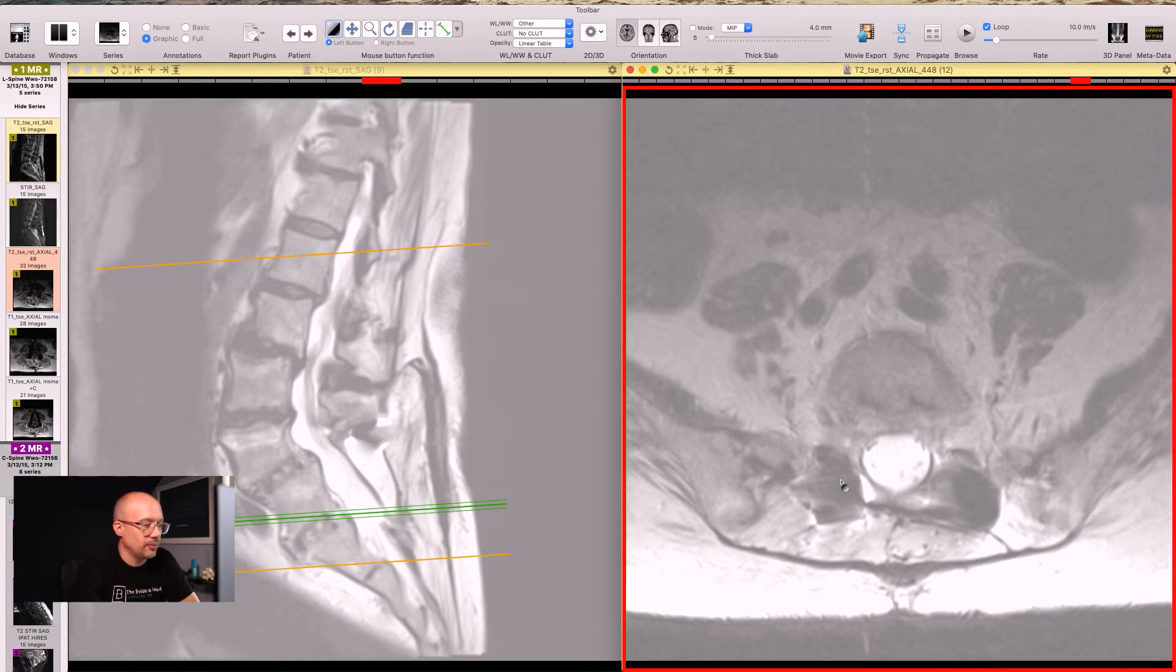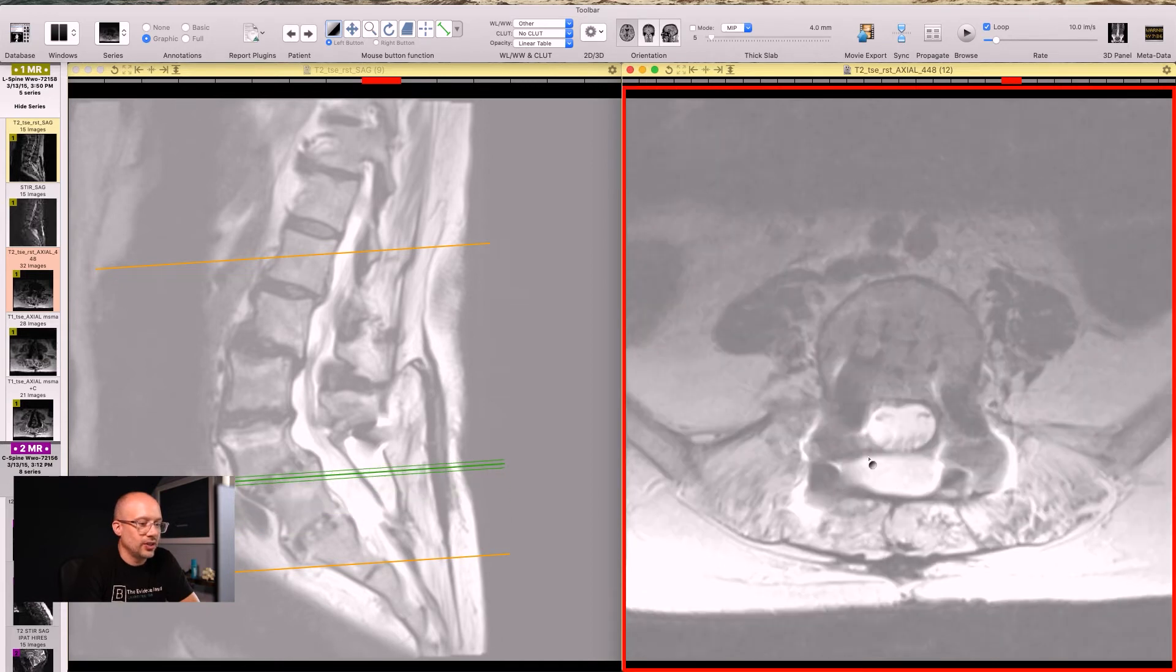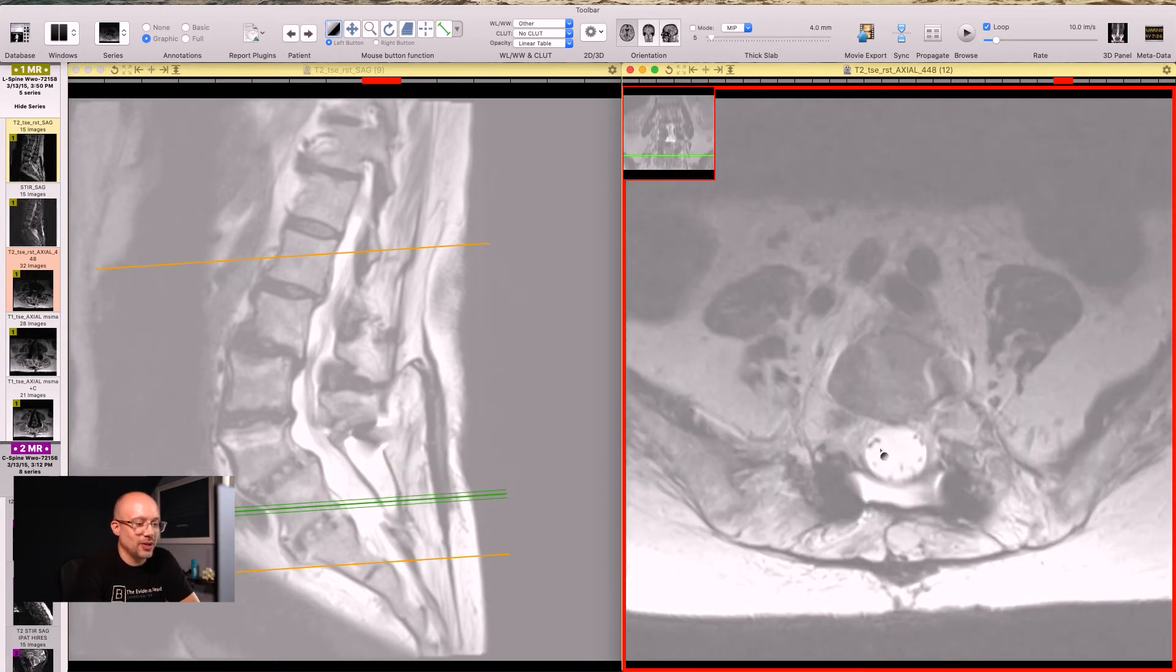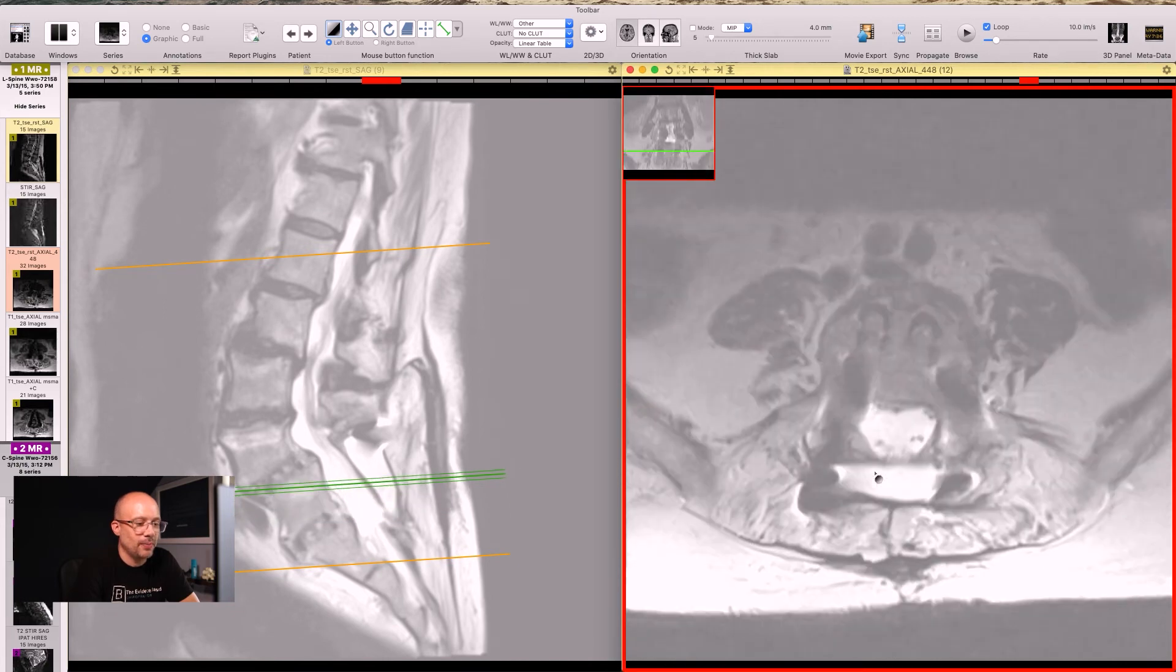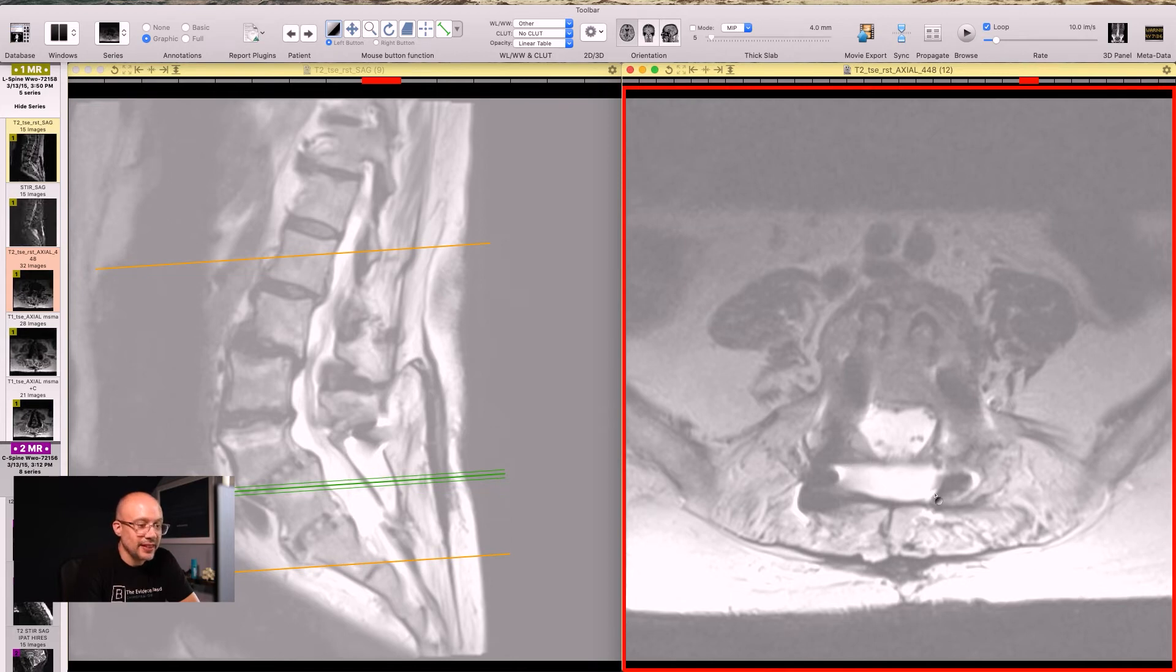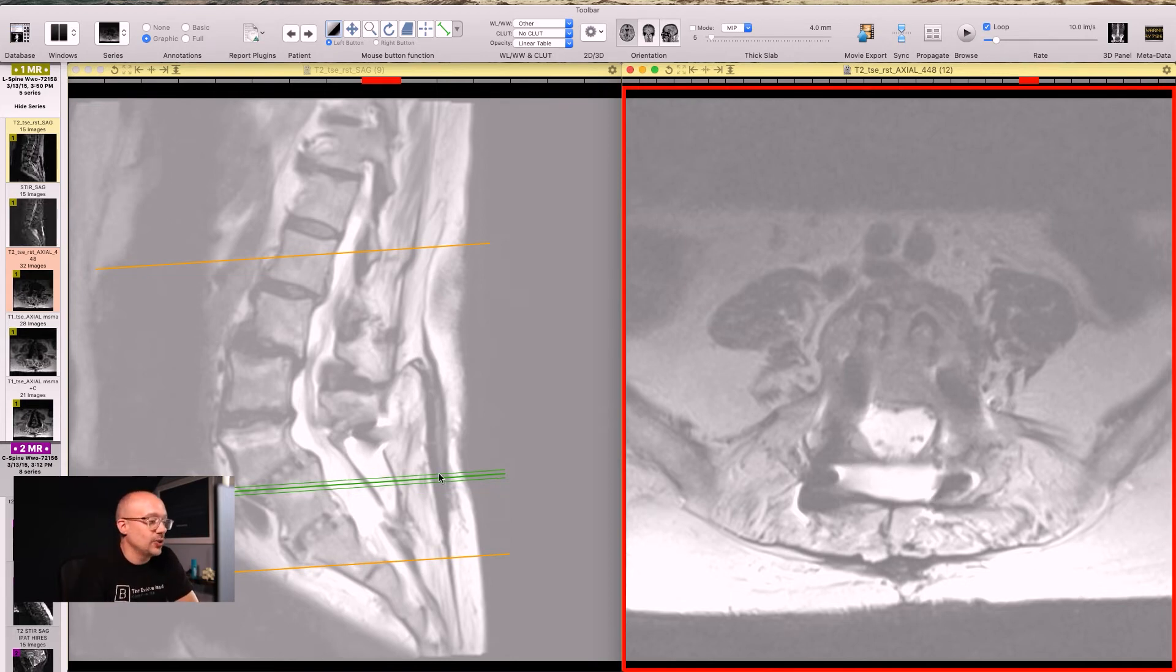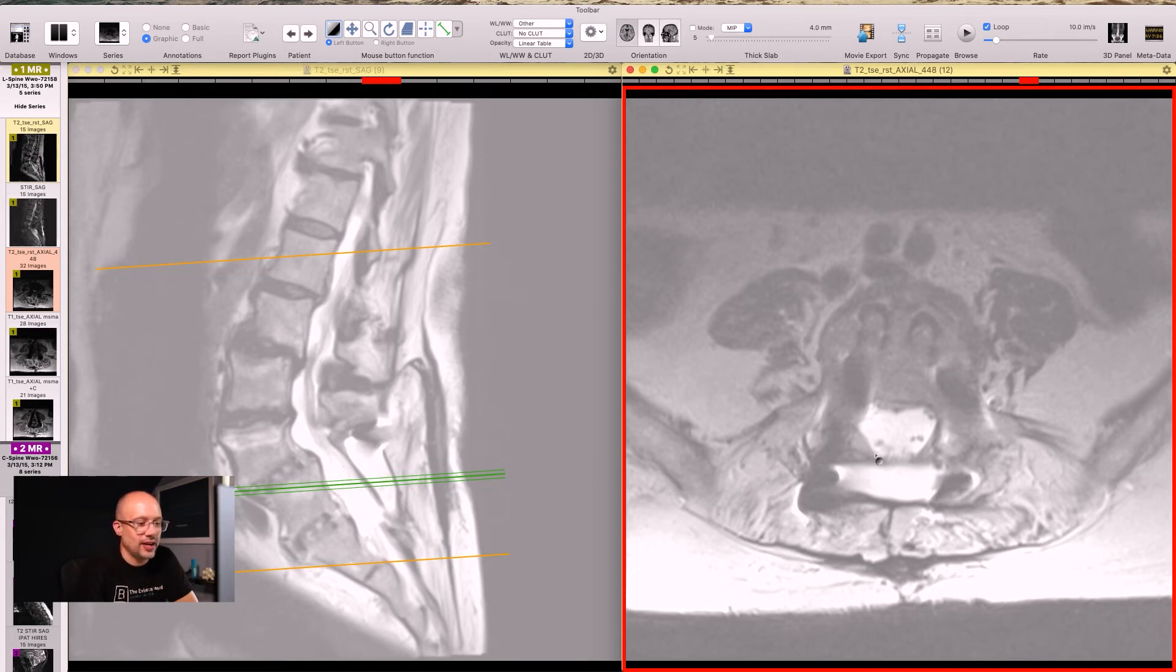Now let's go up a little bit. What you'll notice is, look at all the two white spaces here, right? When you go down on the right-hand side of the screen, one white circle, spinal canal, up a little bit. And we see that second white area. That second white area is the fluid collection. So again, we go back over to the left-hand side of the screen. We can see right now, oh boy, we're right there. We're right where that fluid collection is in back of the spinal canal. You see that right here.